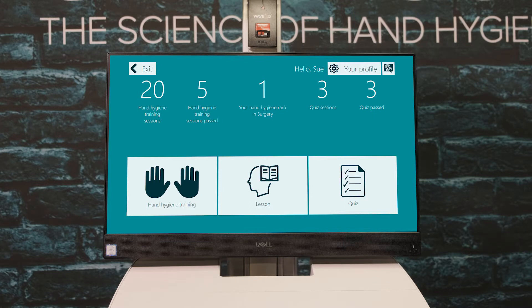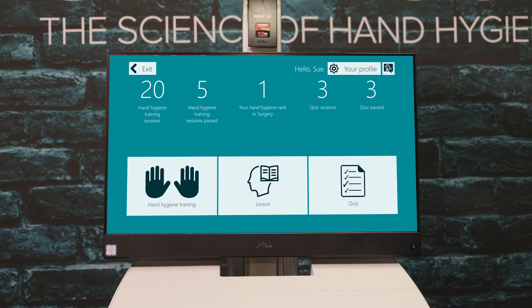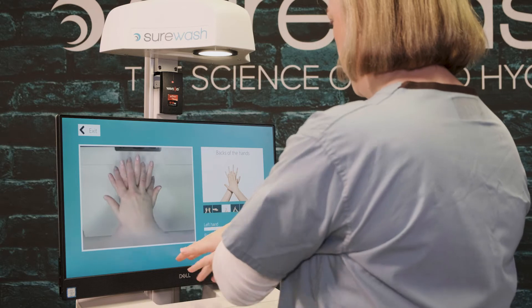Once you've logged into Surewash, you'll have the option to choose between hand hygiene training, taking a quiz, or doing a lesson. This is also dependent on the organization and what you require. In hand hygiene training, there are five different difficulty levels along with the tutorial level. Select the level that you would like to attempt. Make sure to check with your facility regarding nail length and rings.